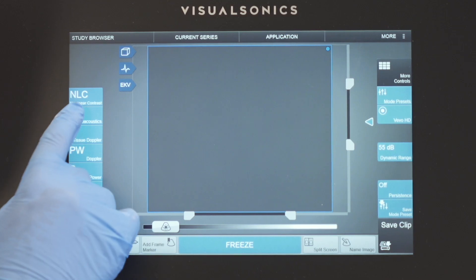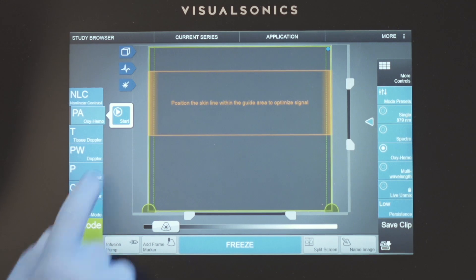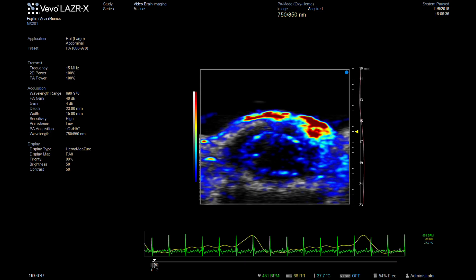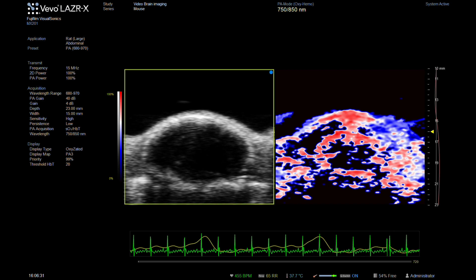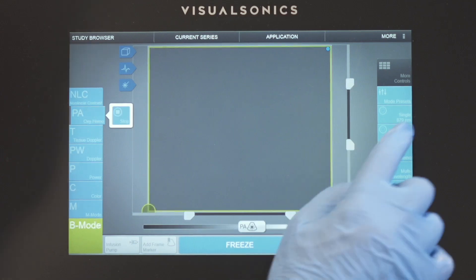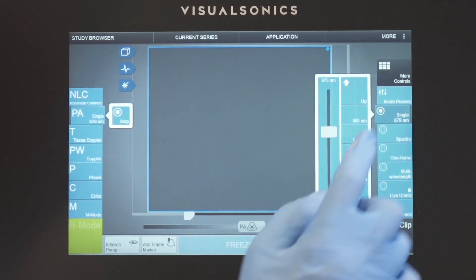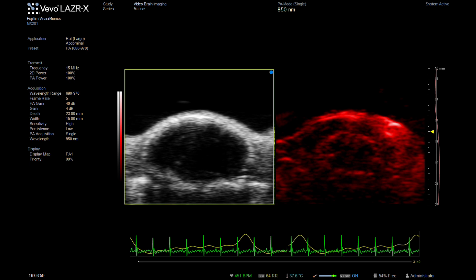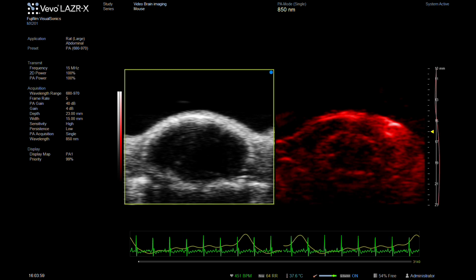Moving into photoacoustic mode means you can determine molecular parameters such as hemoglobin concentration and the average oxygen saturation. By selecting a single wavelength, we can detect the endogenous contrast, which comes from the blood and other tissue chromophores.